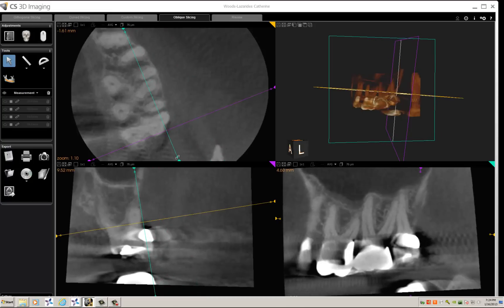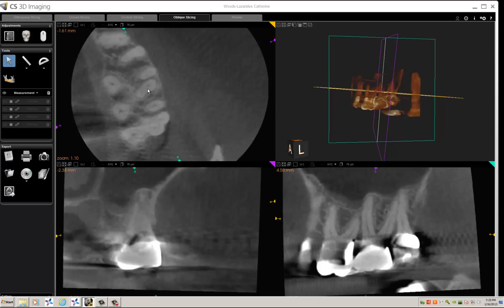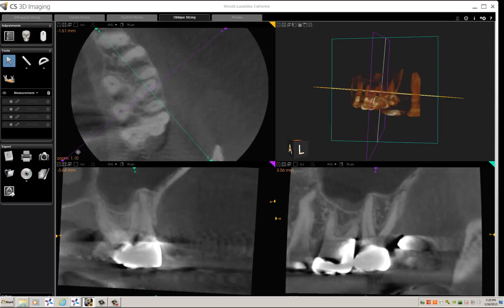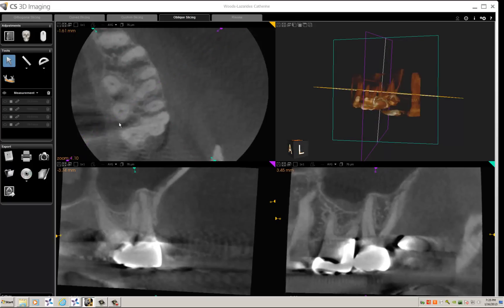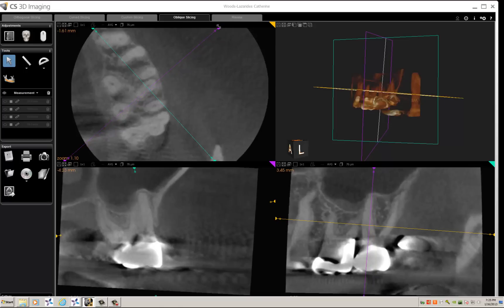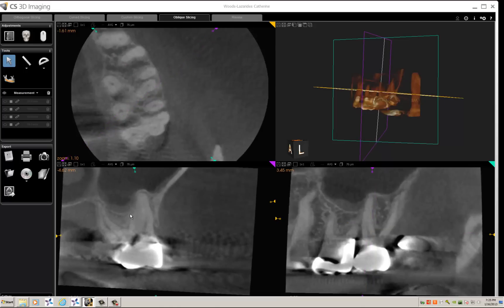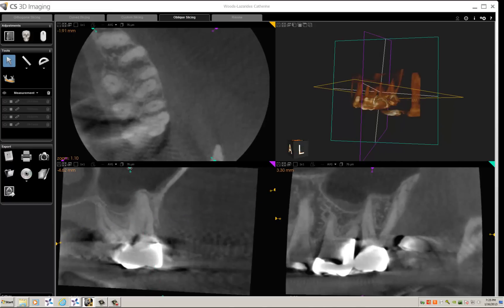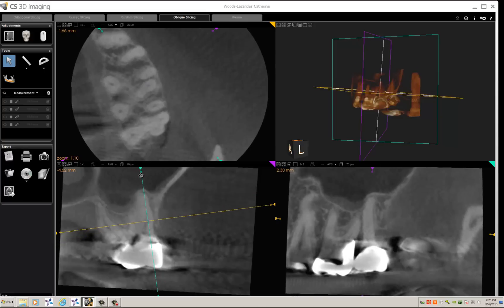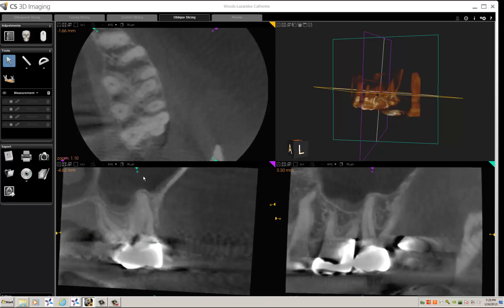Typically I will take the sagittal handle and orient it over the root we will be looking at. Then I will take the coronal slider and line it up parallel to the width of the mesial buccal root, trying to center it right on that root. Then in the coronal section, marked by the purple triangle, I will also line up the sagittal angle according to the longitudinal axis of the root. Then I'll go over to the sagittal section and line that up at the same time.